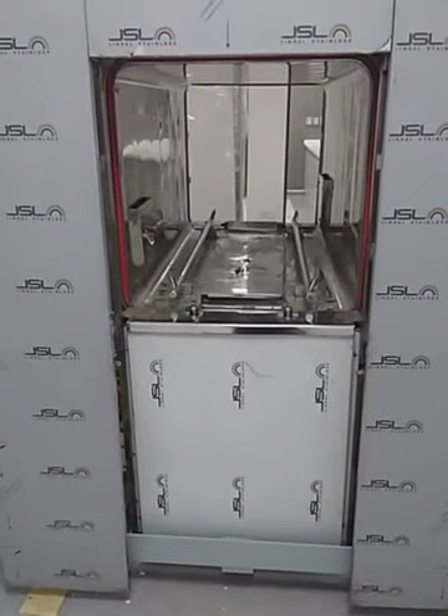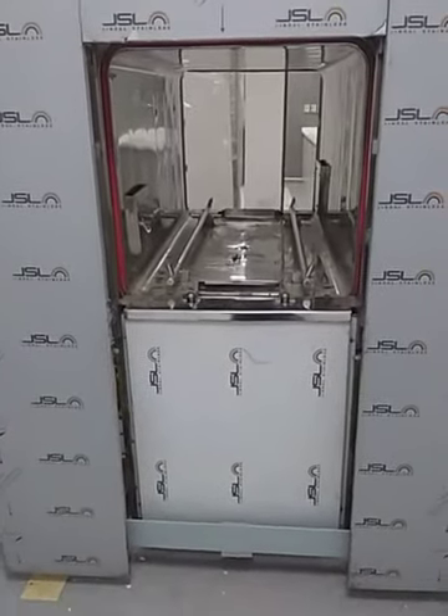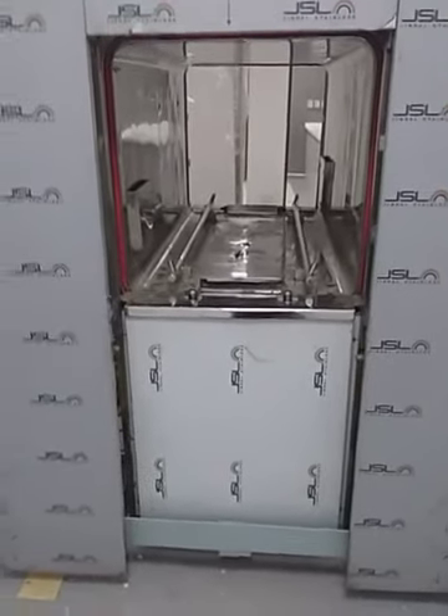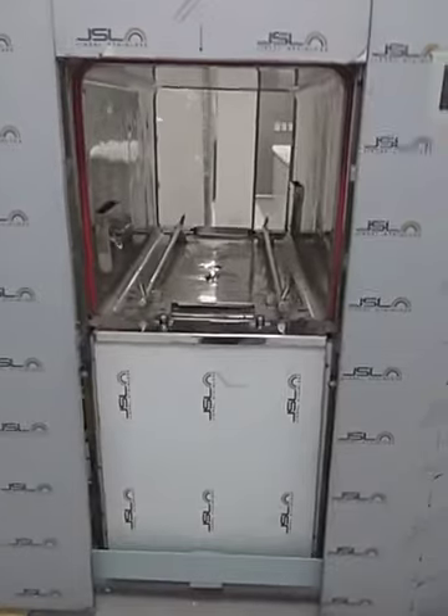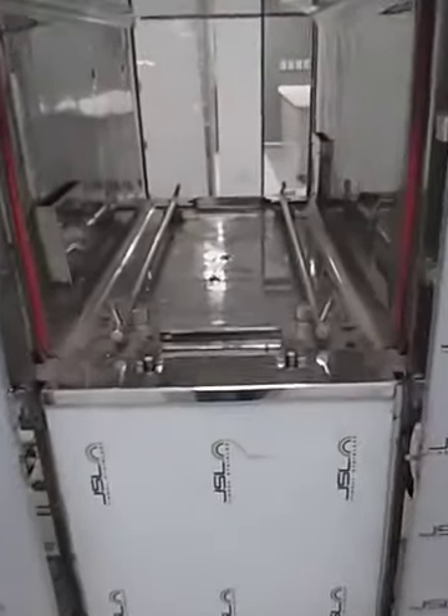So before doing the surgery, all the instruments, all the linen, all the clothes, all the gloves — everything should be disinfected. There should not be any infection. Doctors keep all the loads inside the chamber.